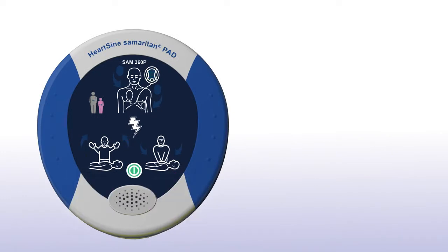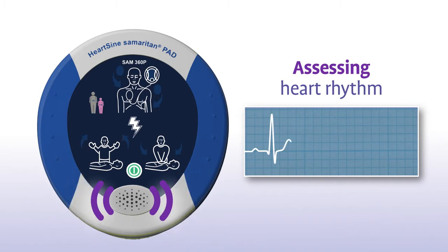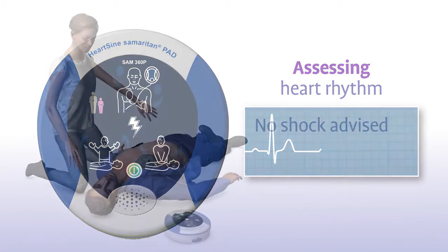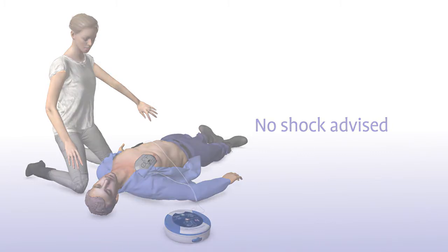Stop CPR. And again, assess the patient's heart rhythm. Assessing heart rhythm. Do not touch the patient. Sometimes, no shock is needed in a life-saving situation. No shock advised. And the Samaritan PAD will tell you in that instance, or advise you to continue to perform CPR.